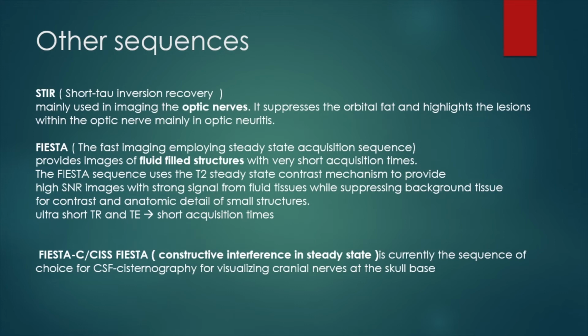And FIESTA-C or CISS, constructive interference in steady state. These are newer sequences. It is currently the sequence of choice in CSF cisternography for visualizing the cranial nerves of the skull base.